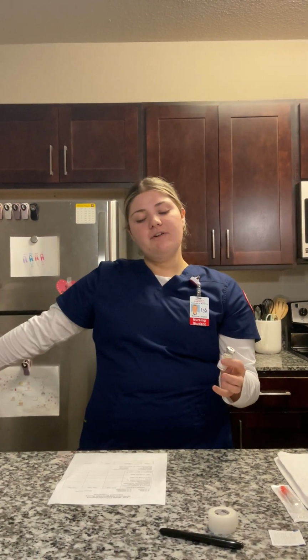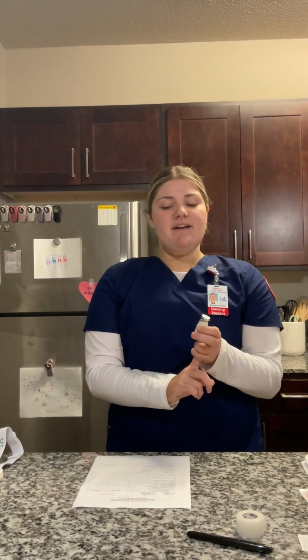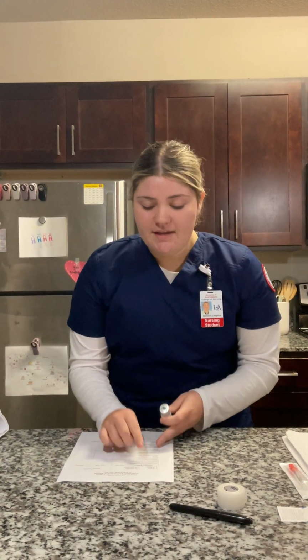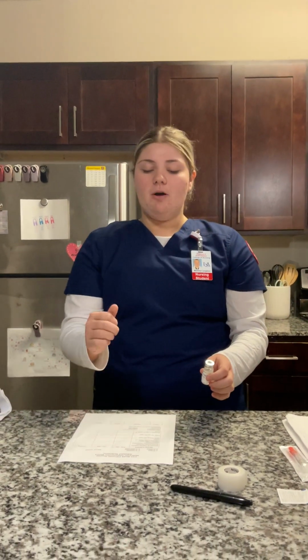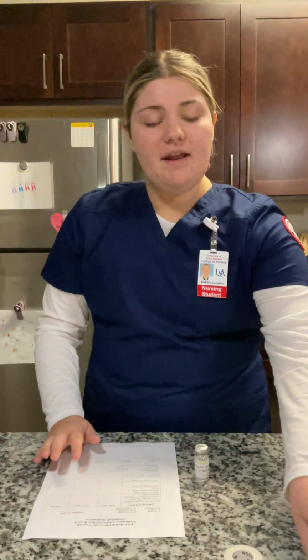Now I'm going to look at the dose. So it's 10 units. This is a 100 unit vial, but I know that my syringe is measured in units, so I can pull back 10 units and be fine, but I will check with another nurse just to make sure my calculations are correct. It is given subcutaneously, and I know insulin is a medication given at subcutaneous injection sites, and it's given 30 minutes before meals and is close to the 30-minute mark before Mr. Jones' next meal.